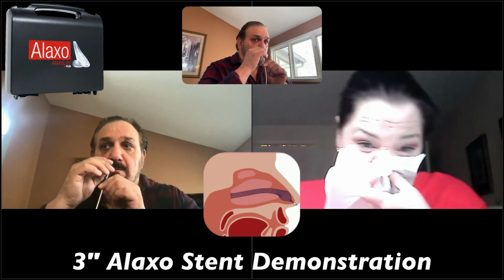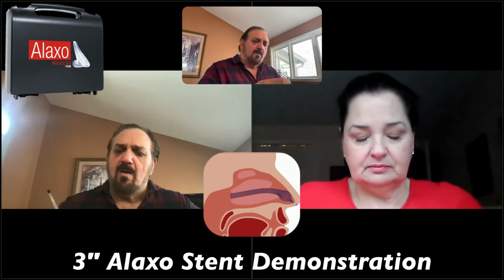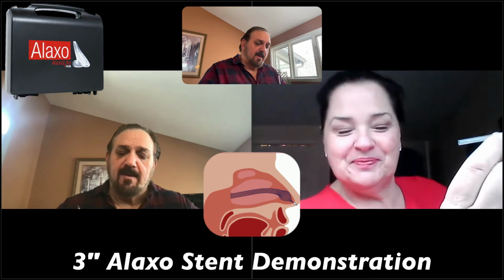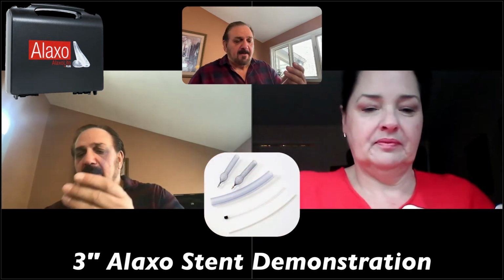You can pull your whole stent out, and we can try again. Okay, so, because this was staying in there, I was pulling on the wrong thing. You're pulling the pusher rod and not the introduction tube. Right. Yeah, so this is the pusher rod. Okay, I got it.